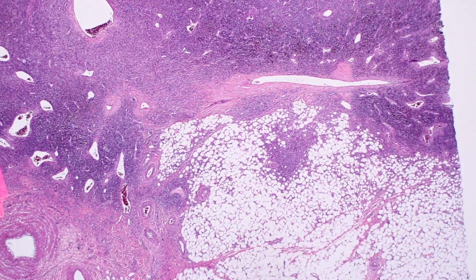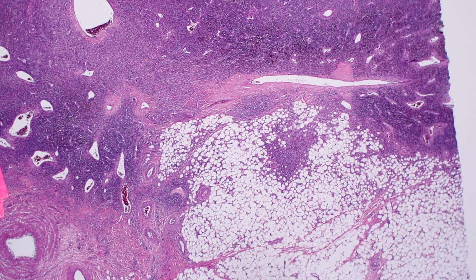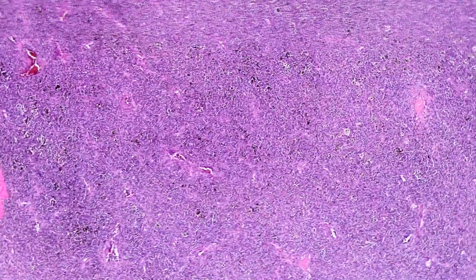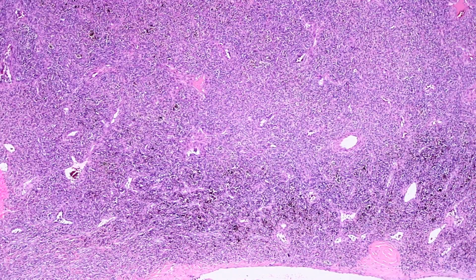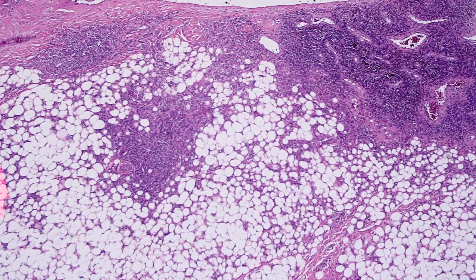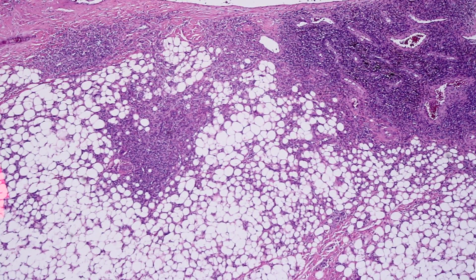For example, I don't care about this, even if this looked kind of more honeycomb, there to me is no way that this tumor we're looking at here could be a DFSP because of all the things I just showed you: the hypercellularity, the large cells, the degree of pleomorphism focally, the foamy cells, the hemosiderin, the blood. Every feature there argues so strongly against dermatofibrosarcoma. But I often see cases like this sent in where the outside pathologist is really concerned about DFSP, which is part of why I'm making this video.